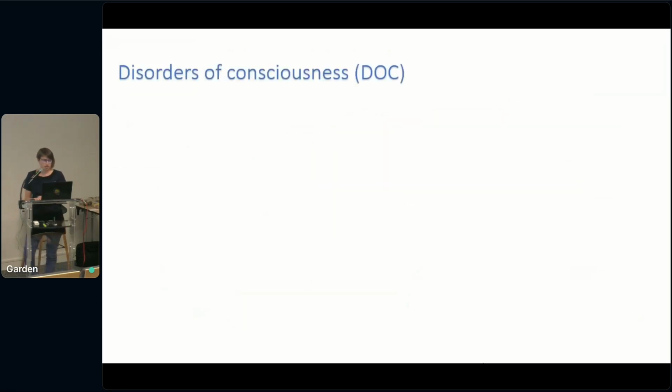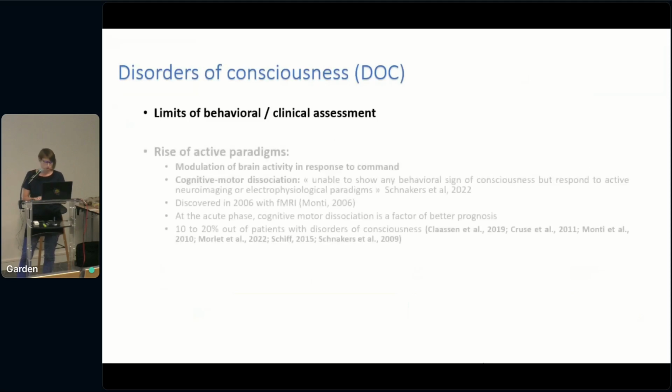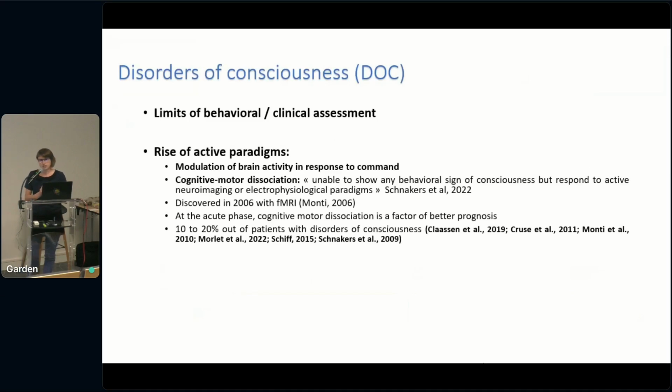So for patients with disorders of consciousness, what could be the use of brain-computer interfaces? As you realized from the previous sessions, there are a lot of limits to the behavioral assessment. So this motivated the rise of active paradigms.